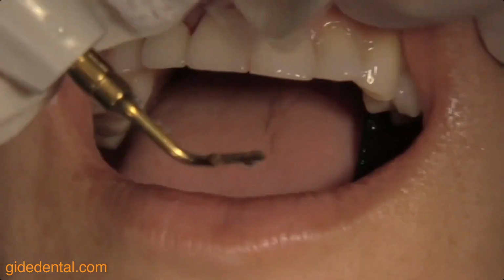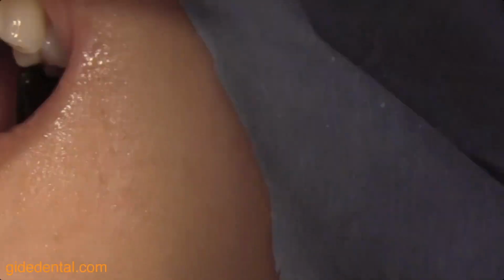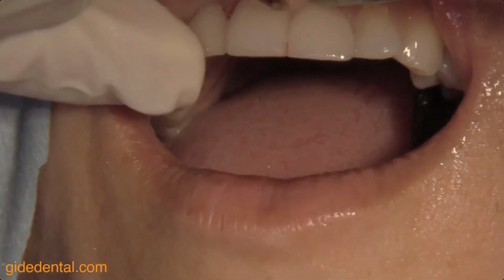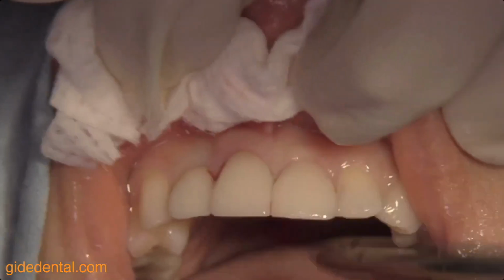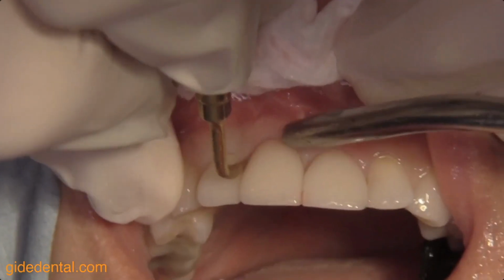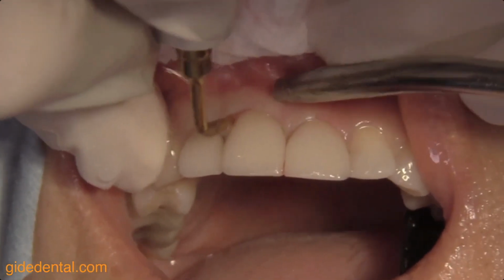The same thing we're doing also on the mesial, and we'll do the same thing also on the posterior. Here we can see the distal being loosened.